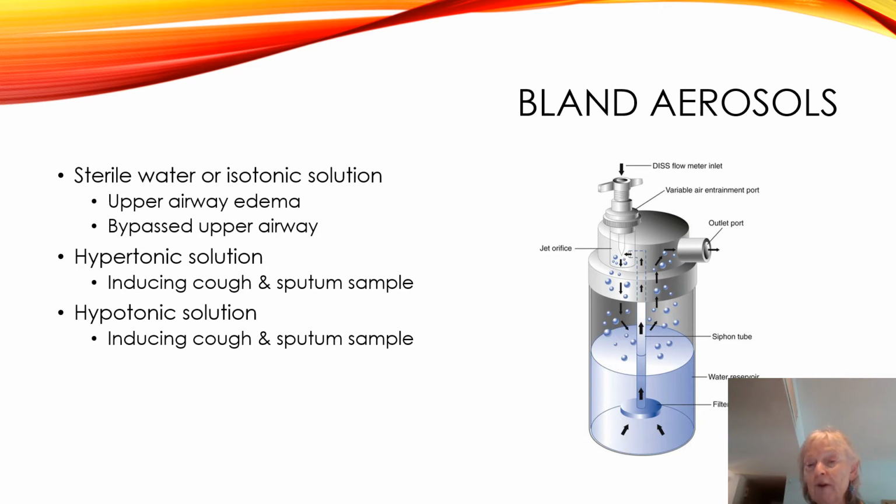You still have capillary tubes in these things. This is what they call a siphon tube because you have to bring that water up in order for it to be acted upon by the gas. There is a water reservoir and there is a filter or diffuser also in there on occasions. More of a filter at this particular point.